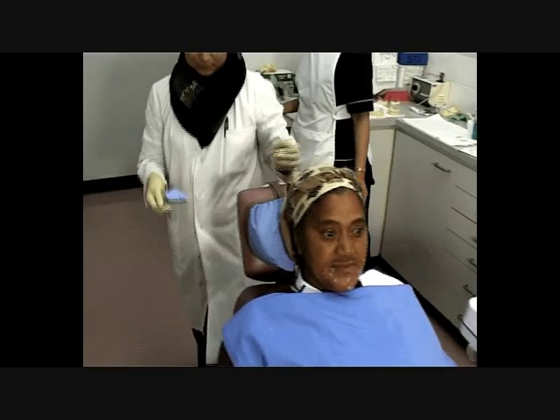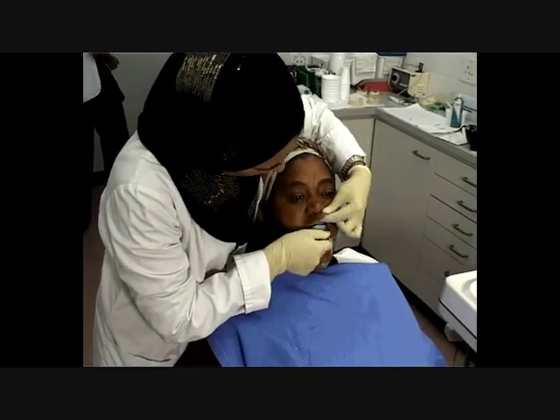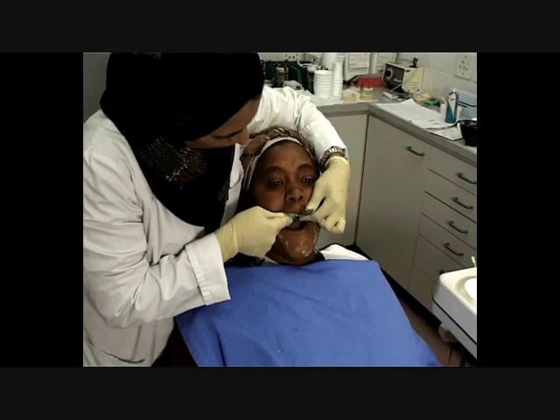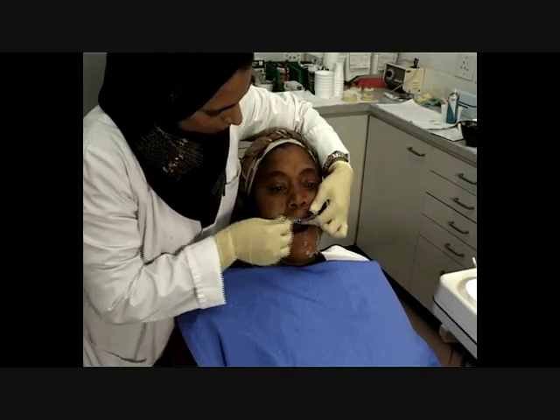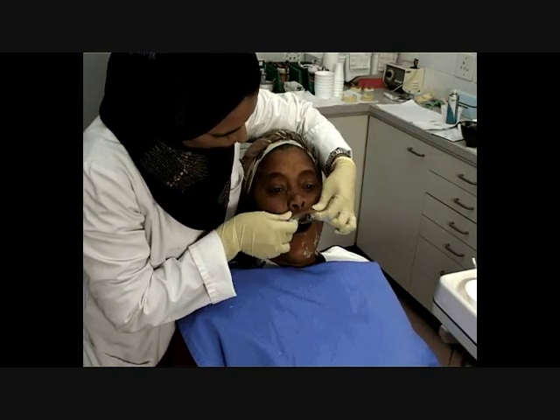Step 3. Place the tray, preferably straight up towards the palate. Pull the patient's upper lip down as far as possible and ask her to open wide and smile broadly, then close the jaw and move from side to side.